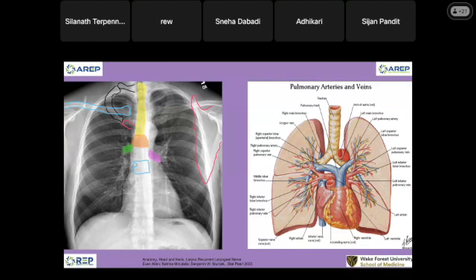It used to be very important because when the tumor is eating bone, the pedicle will go first. From the left atrium, passing through the mitral valve going to the left ventricle. This is the left ventricle. From the left ventricle, the first thing we look for is the blood squeezed out to supply the body. And this is the left ventricular outflow tract.